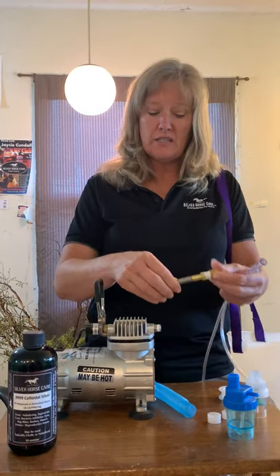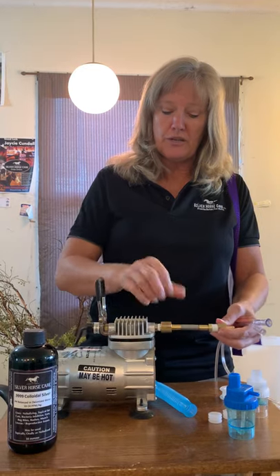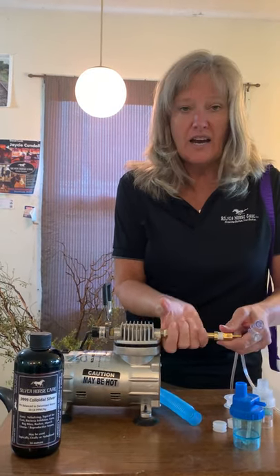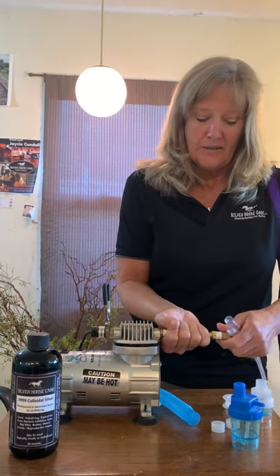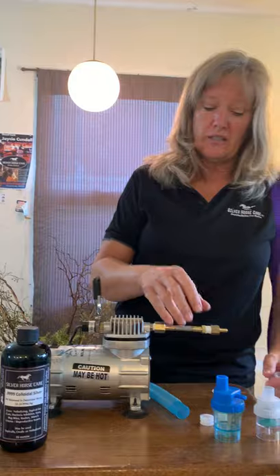You've got one here on the end, and then this one on the compressor. So we're just going to hand tighten this, putting that on the compressor.